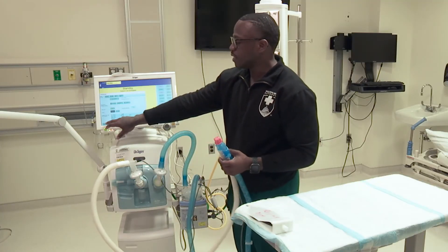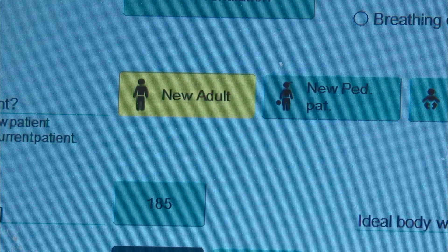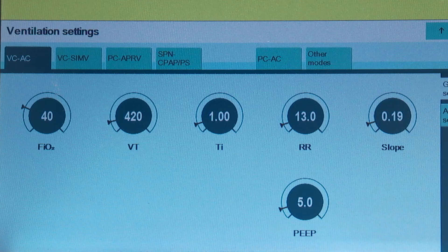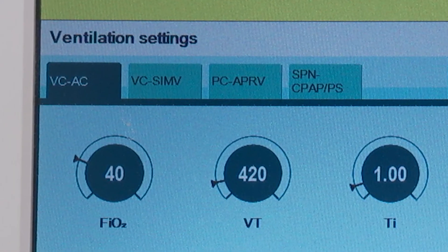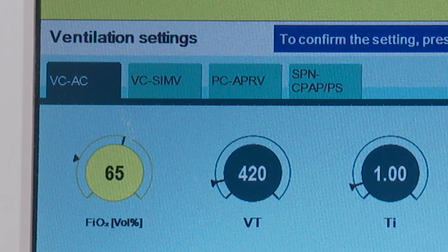I'm going to move over to my ventilation settings. Because we selected an adult patient, if you look at the top left-hand screen, that's an adult body already preset at the mode we're going to utilize. One of the most common modes in the adult ICU is VC-AC. It already presets it to VC-AC based off the height of the patient we input. Because we just intubated this patient and placed them on a ventilator, we want to ensure that we're giving 100% oxygen. I'm going to select the little circle there, turn it all the way up to 100, and then confirm.